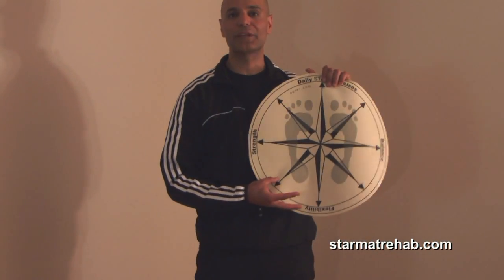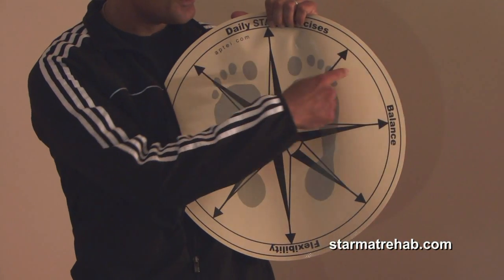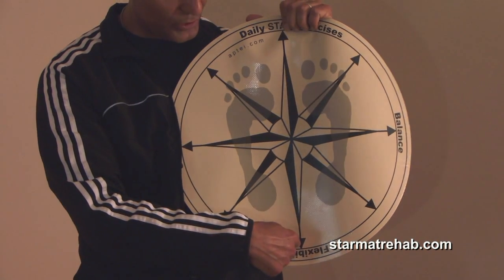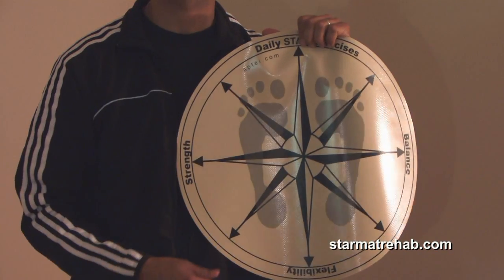The directions we're going to be moving into are basically eight directions: anterior, anterolateral, lateral, posterolateral, posteriorly, posteromedial, medial, anteromedial, and anteriorly again. Let's get started right now.